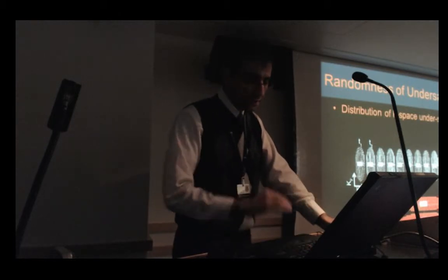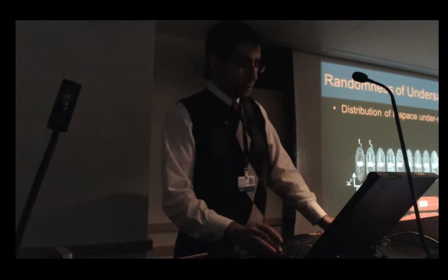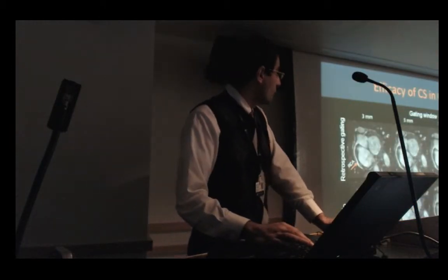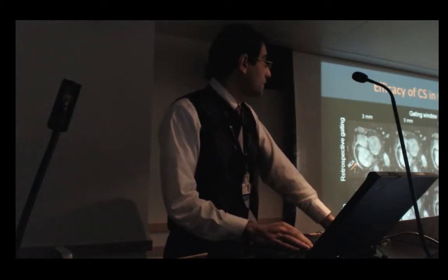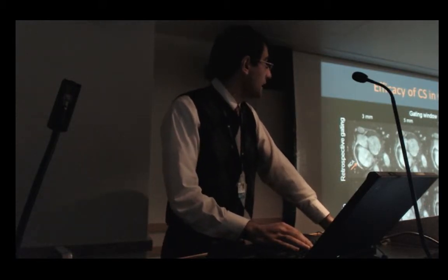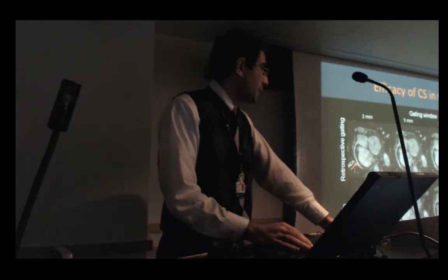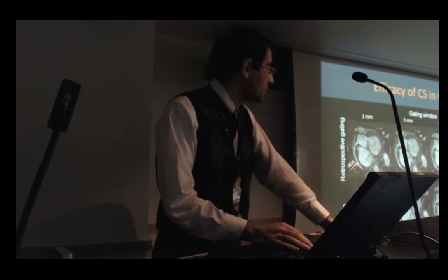I repeated this over 4 volunteers, and again you can see the center has a probability of 1. Yes, we expected that, because we forced the scanner to acquire the center within the gating window without respiratory motion. The outer k-space has a probability around 0.5 because we sometimes acquired those lines within the gating window and sometimes not, due to the respiratory motion. This kind of randomness is good enough for CS to reconstruct our images.